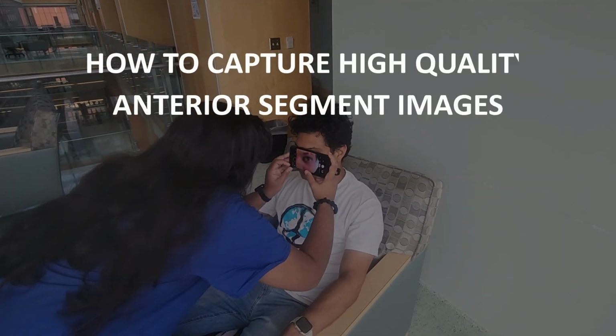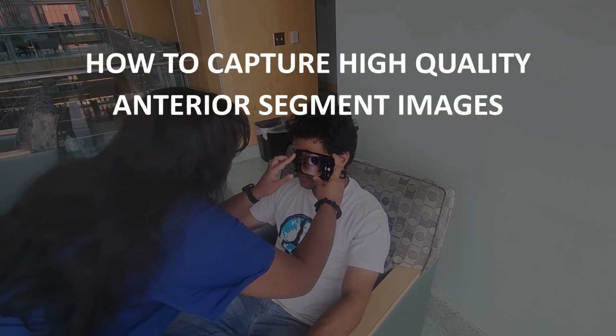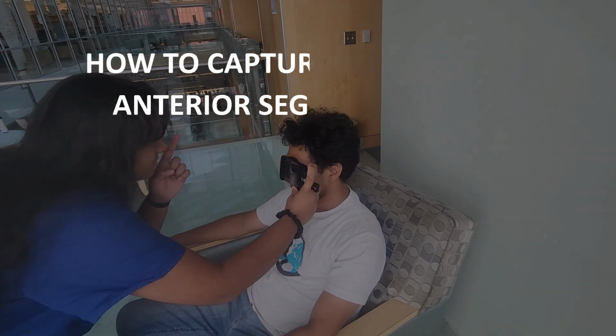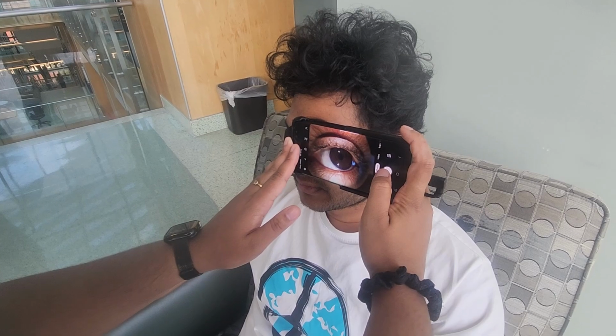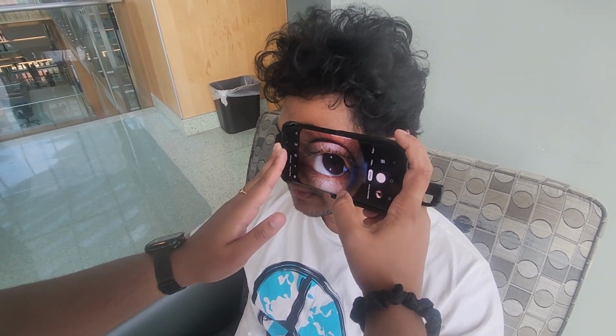In this video, we will show you how to take an image of the eye. It is important to take a high-quality image so the ophthalmologist can have a clear view of the eye and correctly determine what problem the patient has.